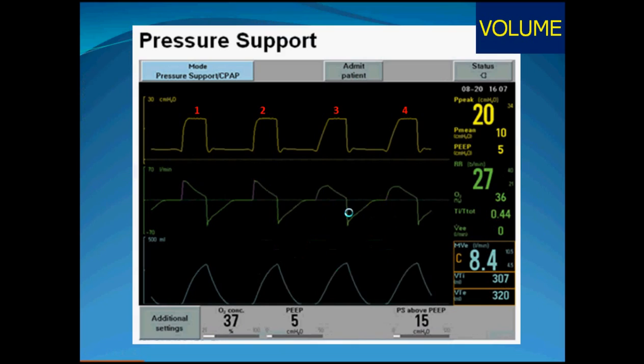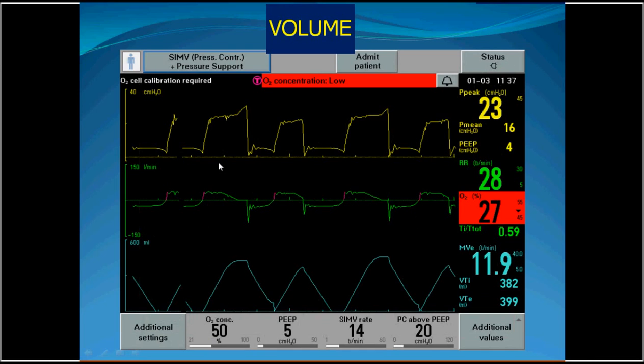so it should be considered. In pressure support also, the tidal volume is defined by the ceiling pressure and the inspiratory time, which is defined by the expiratory sensitivity, which is a percent of the peak inspiratory flow, and this in face of resistance and compliance. Also the same thing as I said, the ceiling pressure should never exceed 40. This means that the plateau pressure will be 30.